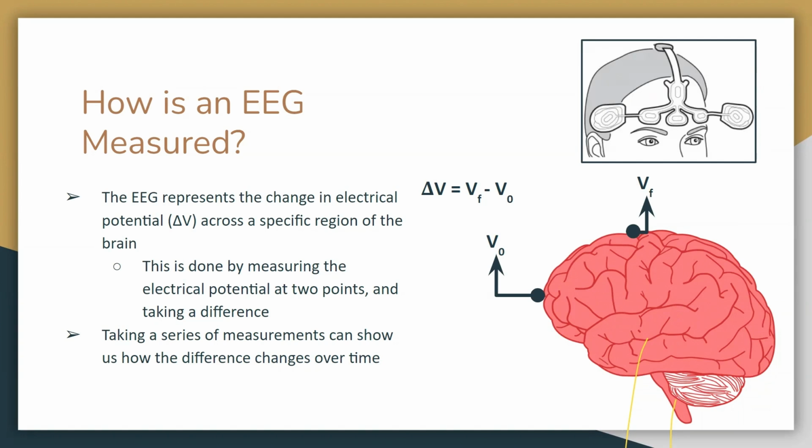I care about the difference between two values. Two values separated by 10 decibels, one will always be 10 times more powerful than the other. Every 10 decibels is a factor of 10. So if I'm 50 decibels down, that's 100,000 times more powerful than the low value signal. I care about the difference, but where I define 0 is arbitrary, and that's up to the clinicians to set.